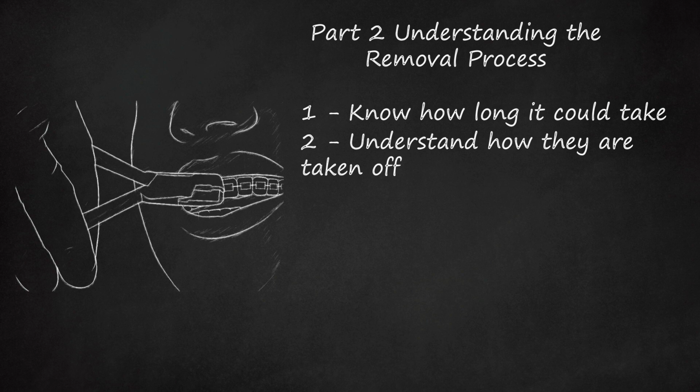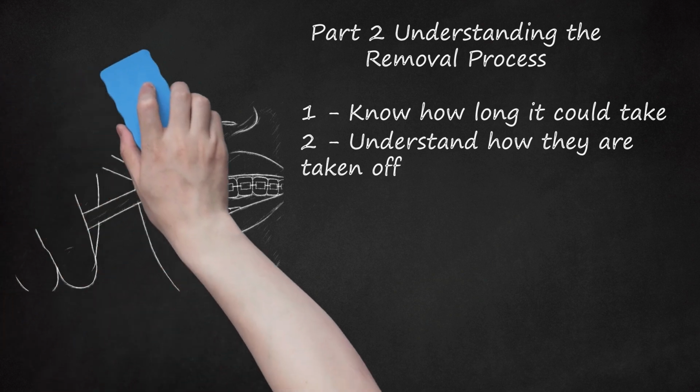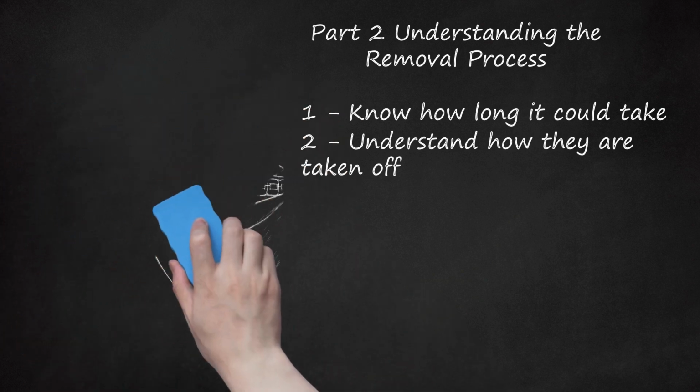Some ceramic brackets are designed to break apart as they are taken off your tooth. If you hear some cracking noises or other odd sounds, just know that this is absolutely normal. Don't worry if you hear anything like this. If you have bands across individual teeth, the dentist will remove these with pliers. You will feel some pressure when the brackets or bands are removed, but little or no pain.